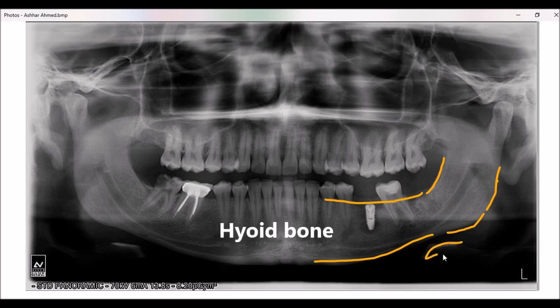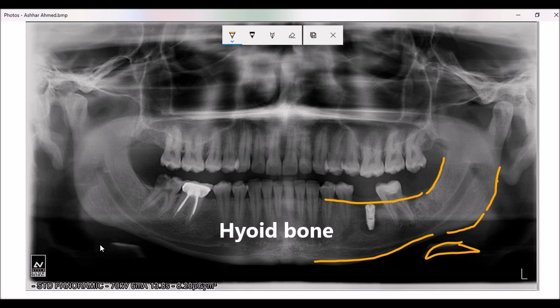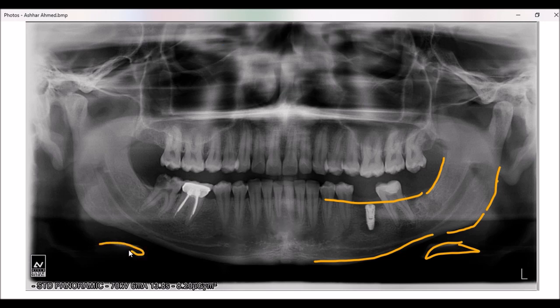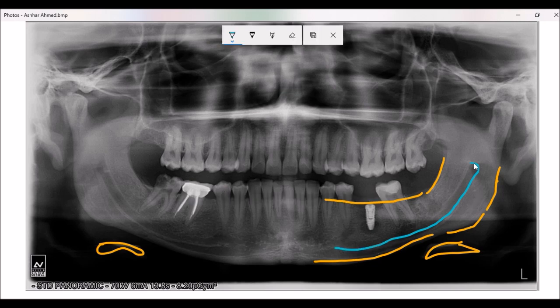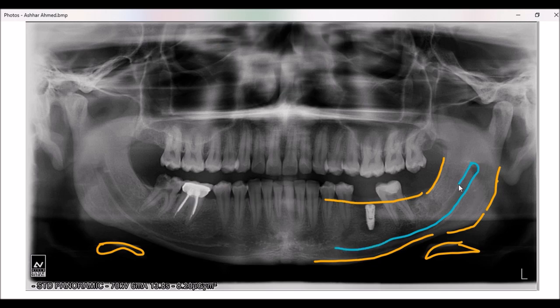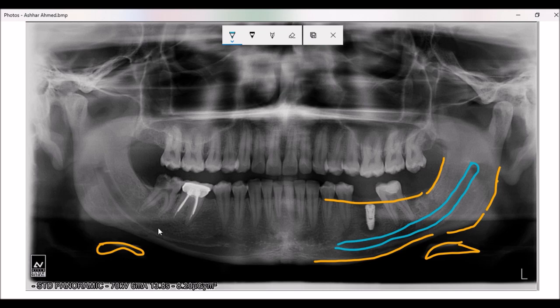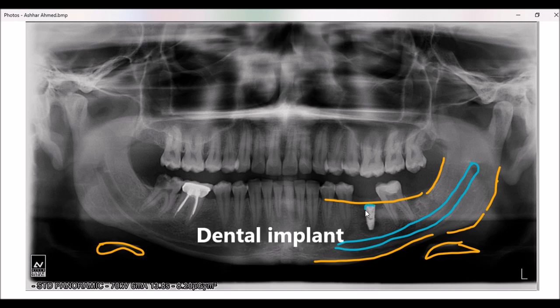These shadows are of the hyoid bone — this is the hyoid bone. Here you can follow my pointer to the inferior alveolar canal. This is the inferior alveolar canal from its origin all the way to the premolar area. The mental foramen are not quite visible.